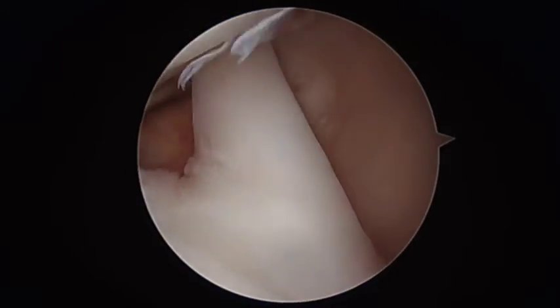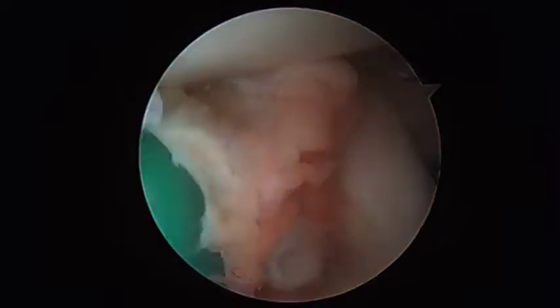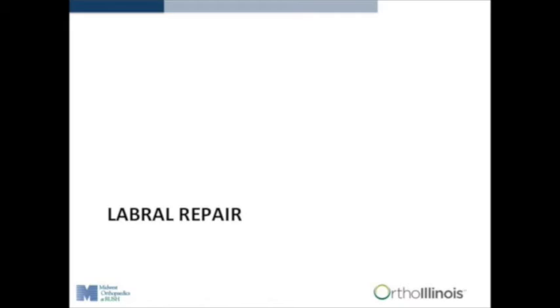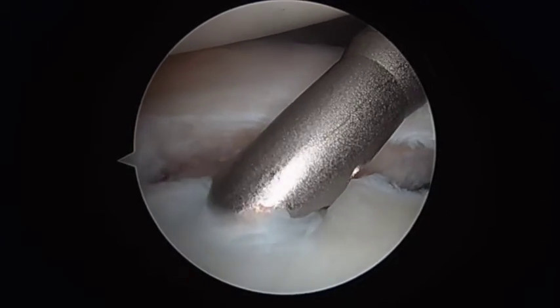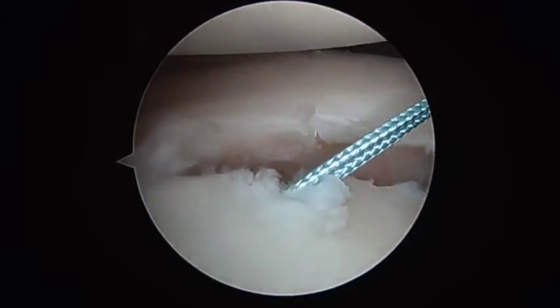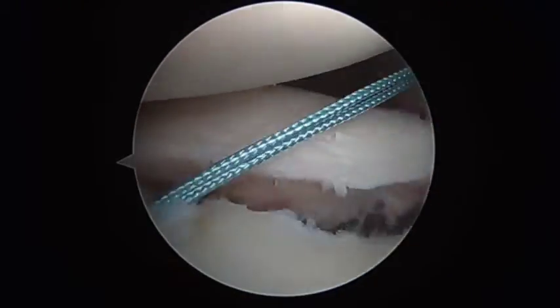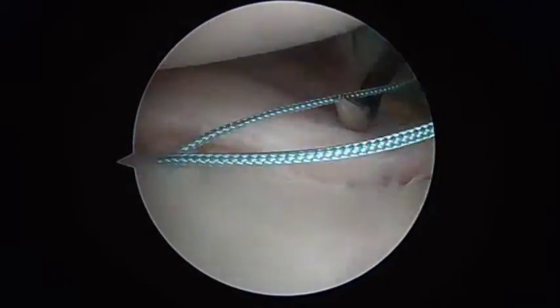This unique pattern was a variant in which the labrum was torn off the bone, but also the capsule more anteriorly, demonstrating a floating labrum. Viewing posteriorly, the anterior-inferior interval portal and additional anterior-superior portal were utilized to allow for both the grasper and suture passer to work in the same area. Attention was then turned to the glenoid neck. This area was debrided to a light bleeding surface to promote healing.